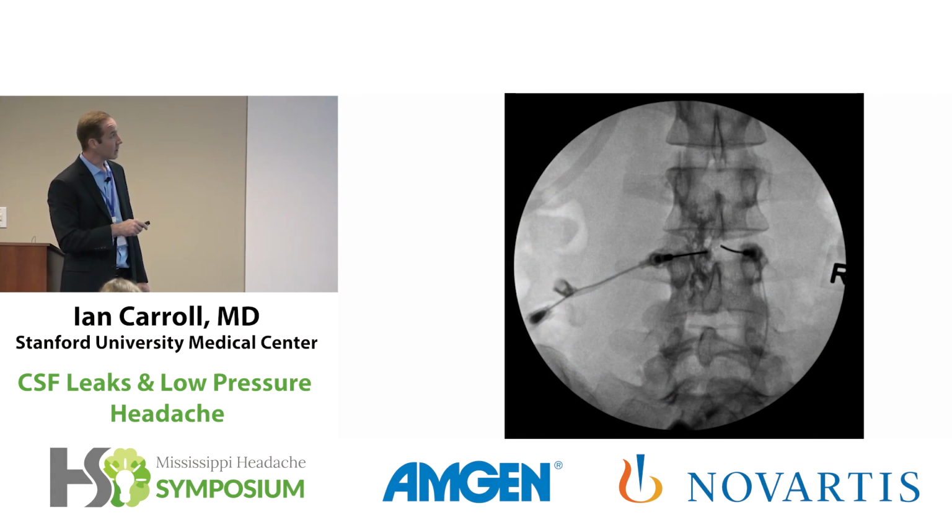And remember, see here again, here's a different patient, the same finding. You give contrast through this needle that's on the left side of midline, you don't get any spread at all to the right side. And because she came a long way, I wanted to make sure that I got both sides of midline in case they really hadn't been on the left side of midline.